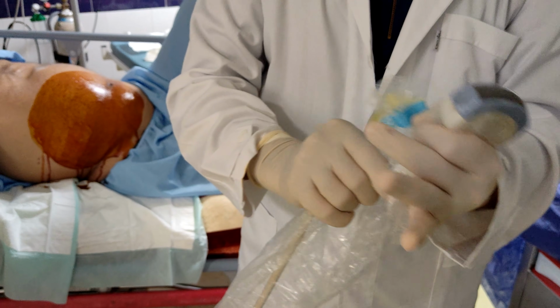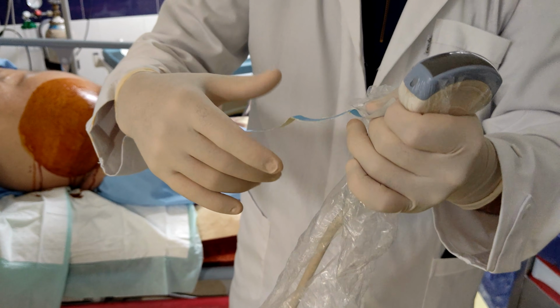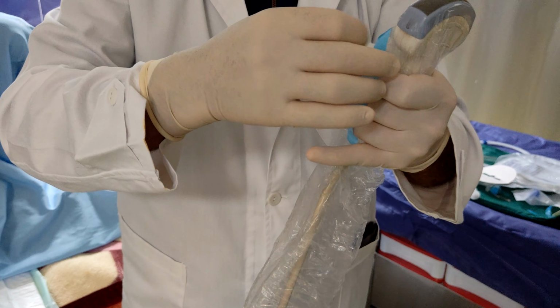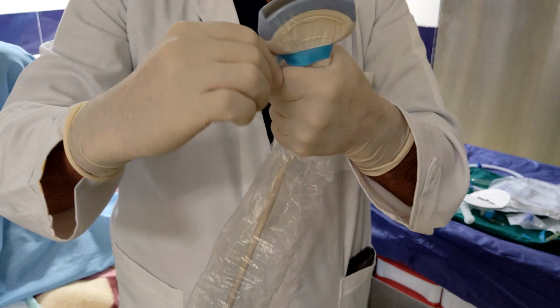Before starting the procedure, careful preparation is essential. Review imaging to confirm ascites volume and distribution, check coagulation profile if clinically indicated, and exclude signs of active infection at the abdominal wall.